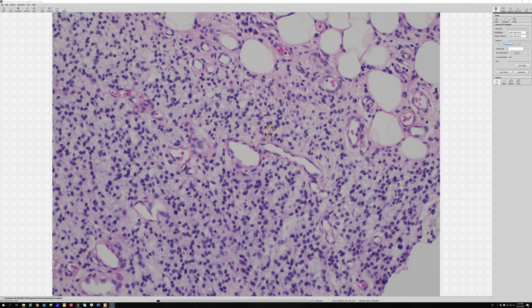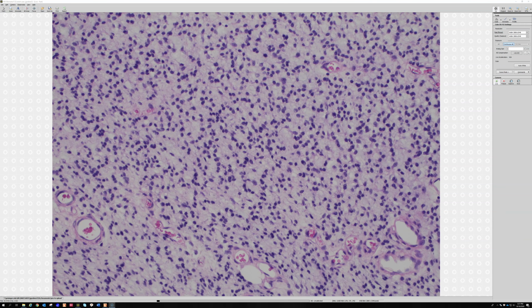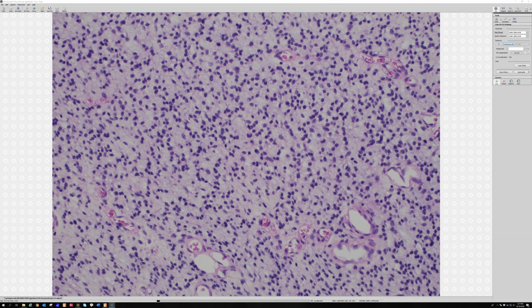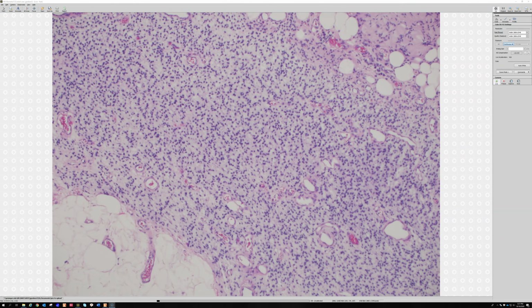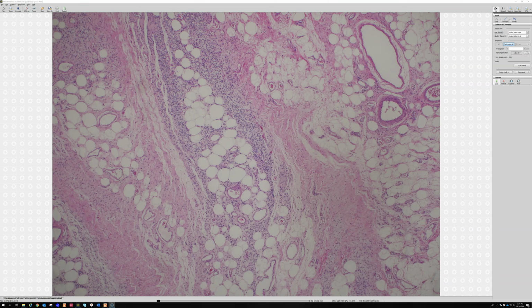And like all neurofibromas, there are often little mast cells floating around in that background, because the background of neurofibromas and some other neural proliferations often has a bit of a hyaluronic acid, glycosaminoglycan, myxoid or mucin substance, very delicately intermingled between the Schwann cells and the collagen. And wherever the mucin or myxoid stuff is, mast cells tend to like hanging out there. So, another diffuse neurofibroma with some really nice Wagner-Meissner bodies.